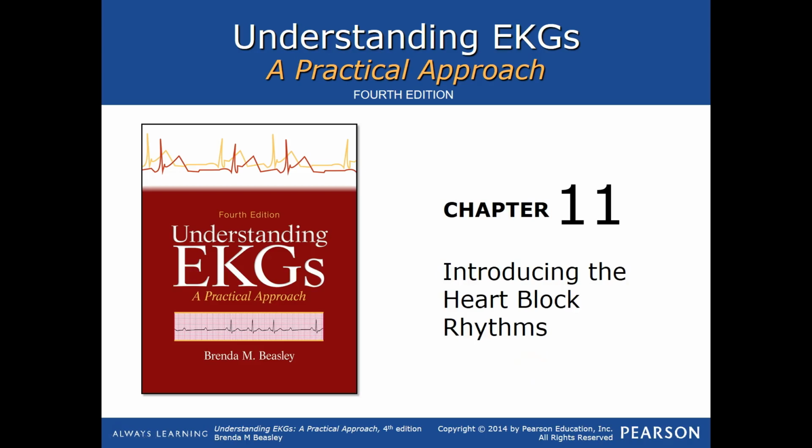Chapter 11, Heart Block Rhythms. This one's actually kind of fun, I think. Now, I'm going to give you guys a few little hints and tips when we get to a certain point to help distinguish these heart blocks, and I hope that you'll take these to heart. Let me share with you.